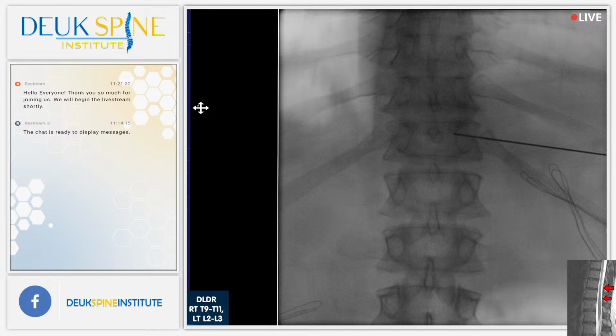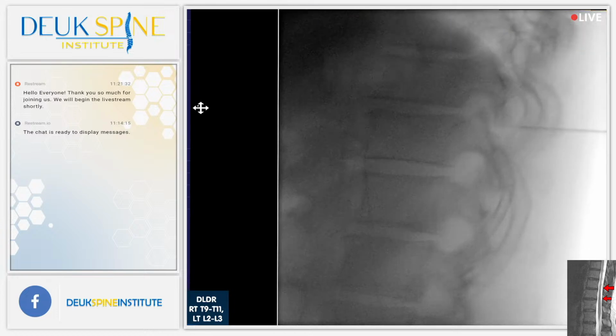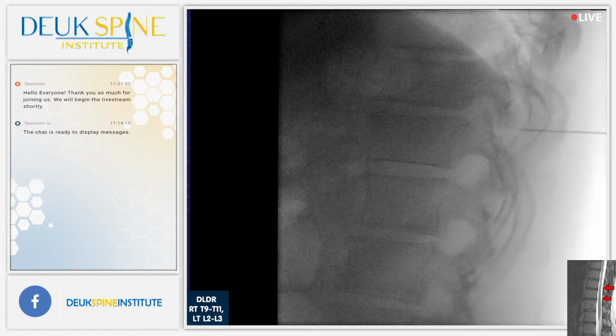All right, back to a lateral view. So here's an example of somebody with 11 ribs instead of 12 ribs. And a lot of surgeons will make their determination in the thoracic spine as to what disc you're operating on based on rib counting, but we cannot use rib counting here.